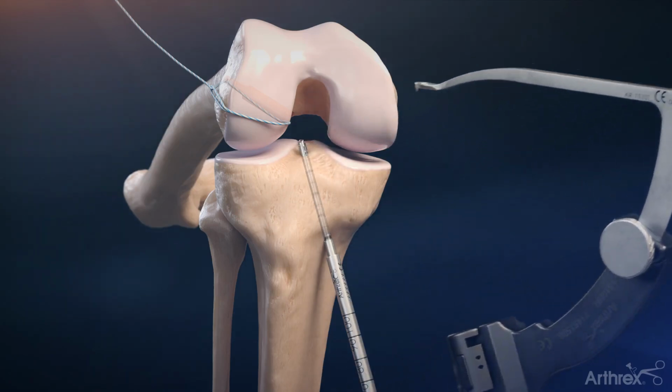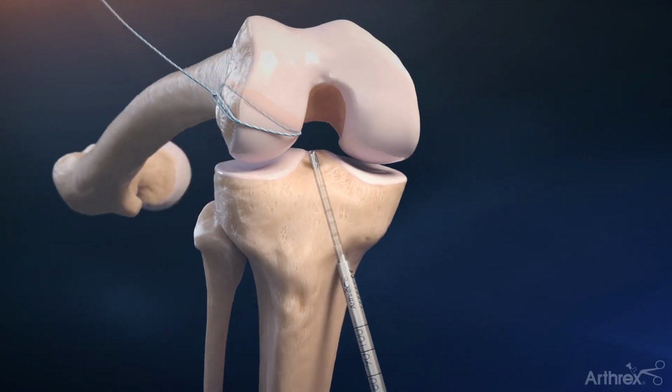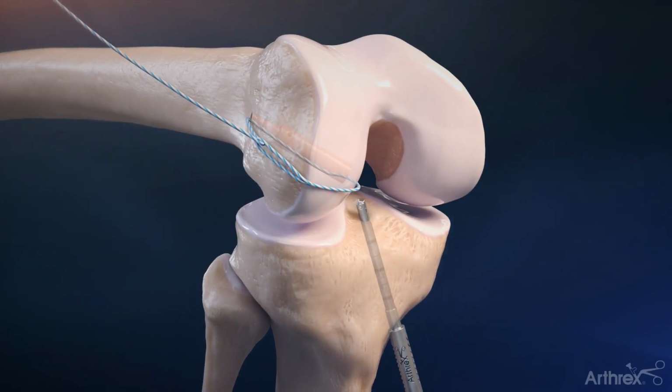Tap the tapered portion of the stepped drill sleeve into the tibia 7 mm or until resistance is felt when reaching the tibial cortex. Using the wheel, deploy the FlipCutter III drill to the appropriate size and retrograde drill back to the sleeve to create a socket.